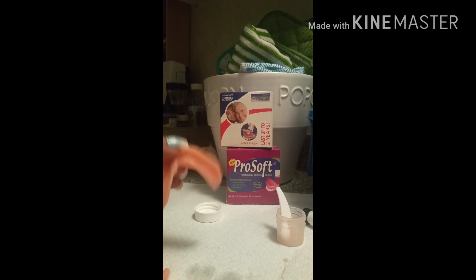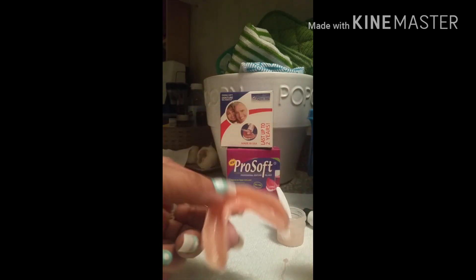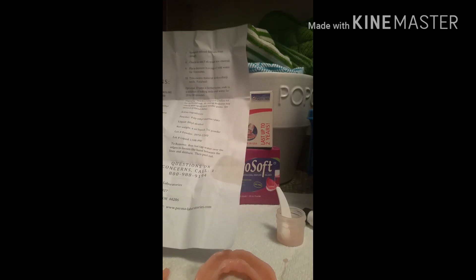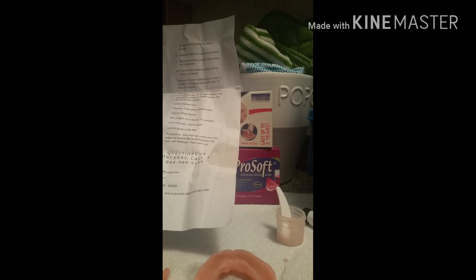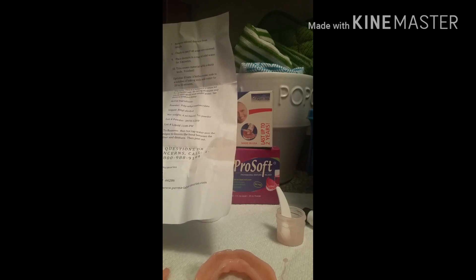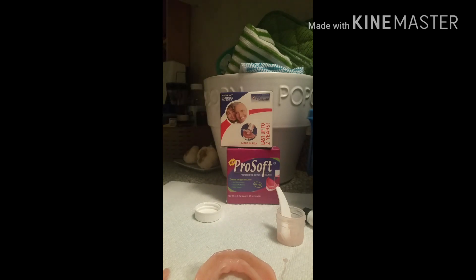I just pulled it out — I do have to trim it up. Let me read something real quick. On step eight: check to see if all areas are covered, place the denture in a cup of cold water for three minutes, then trim excess material with a sharp knife — and we're finished! Okay, going to put it in cold water now.